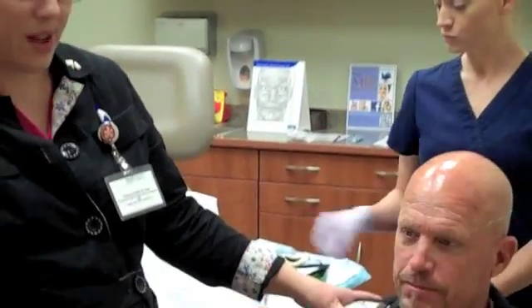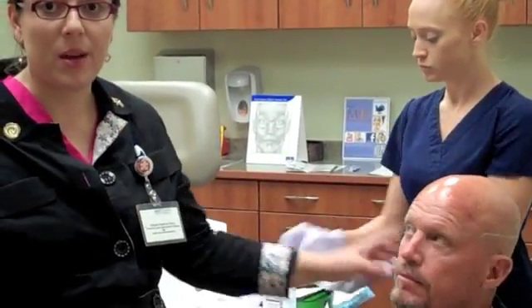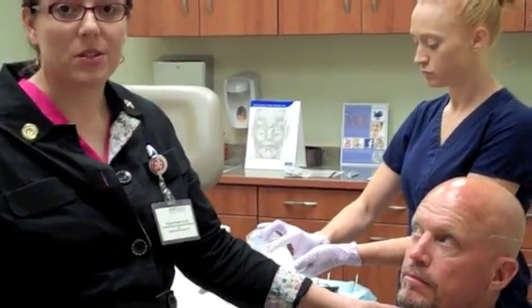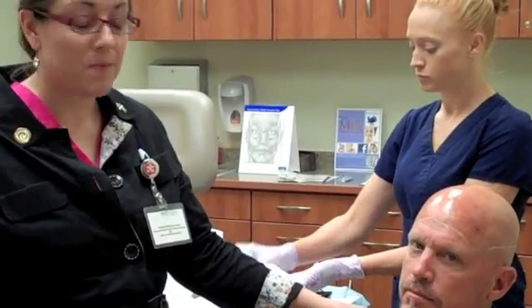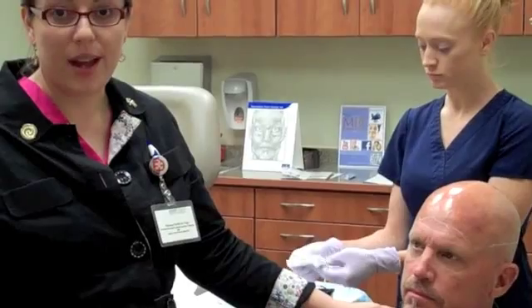Mr. Stevens also has a large fan that he is in charge of, so he is going to put it where there is a hot spot if he feels it. And that, along with the numbing cream, means 95% of our patients tolerate this treatment very, very well. He also will have a little clicker with the blue light, so if he feels that it's burning too much he can always turn the light off. He is in control of that too.